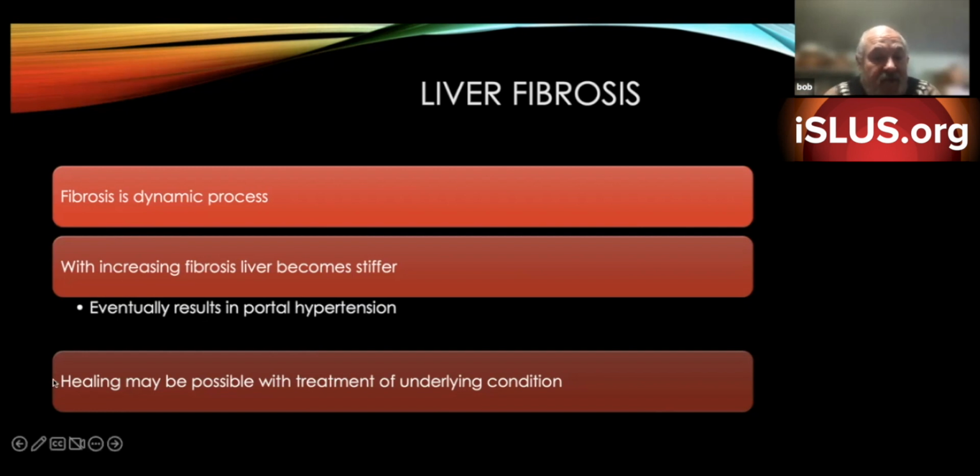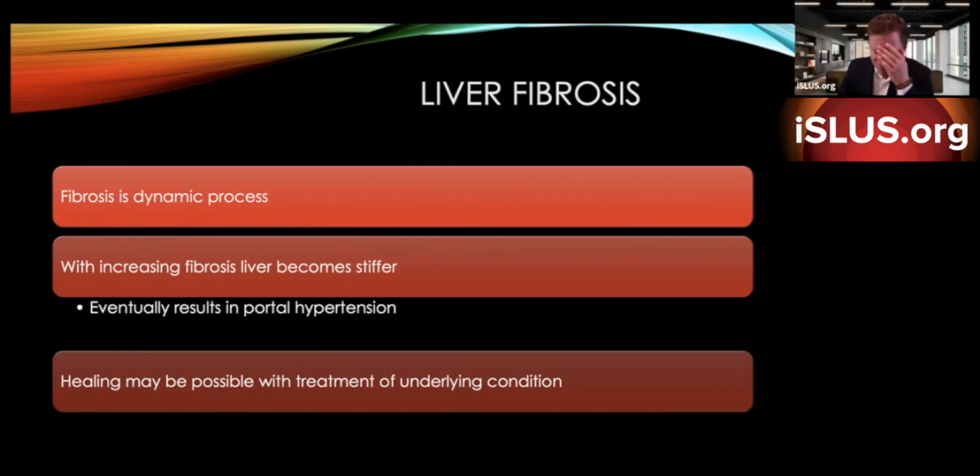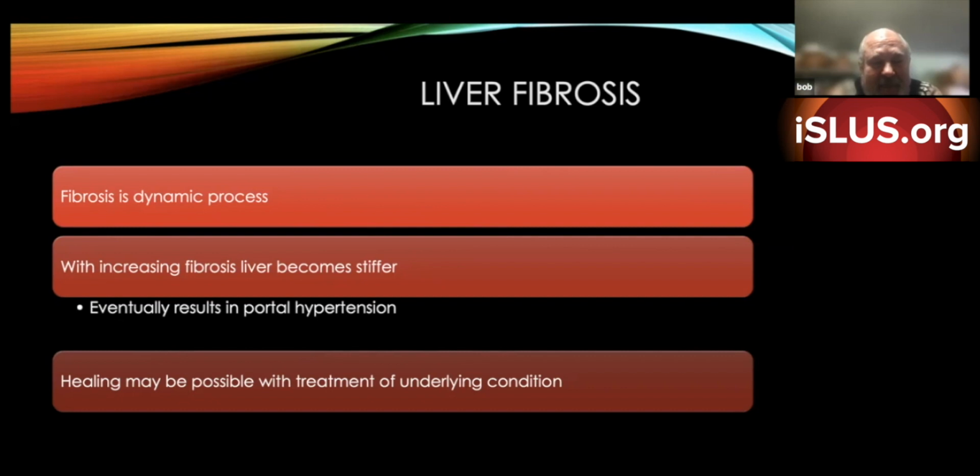Eventually, what we'd like to try to avoid is it'll result in portal hypertension. The portal vein, from what I understand, people do throw color on there, and the gastroenterologist or whatever, they want to look at the portal vein, and there might be some changes in it. Like, what do you actually look for under ultrasound for that?